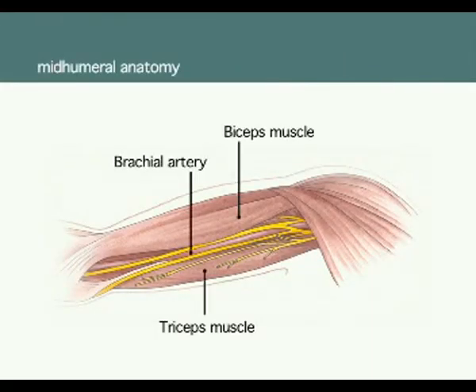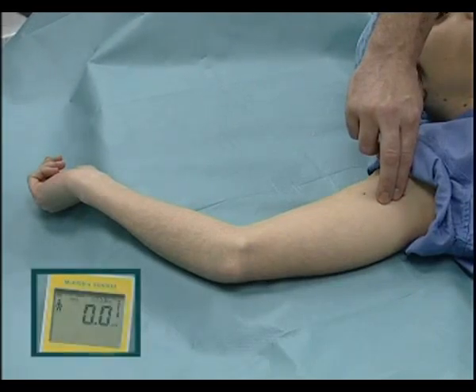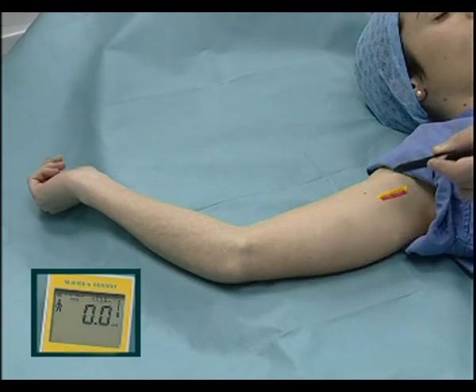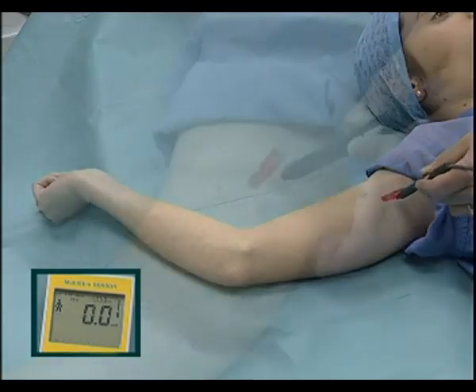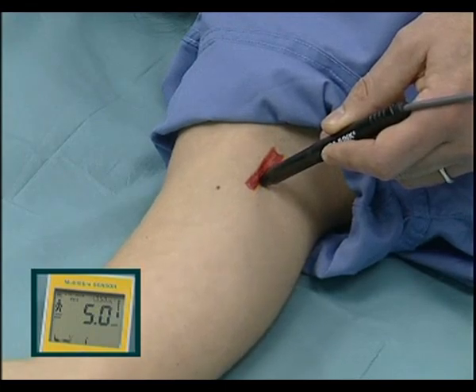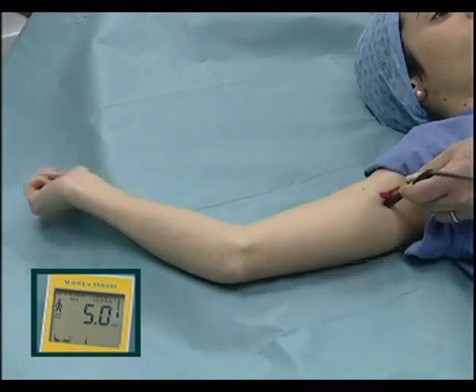Mid-humeral approach. Key landmarks are the brachial artery and the muscle bodies of biceps above and triceps below. Paresthesia is local. Motor response, due to the close proximity of the nerves to one another, is often mixed. We can see median nerve stimulation, wrist flexion and forearm pronation, followed by a mixed ulnar and radial stimulation, medial finger flexion, wrist flexion, triceps twitching, and forearm extension.